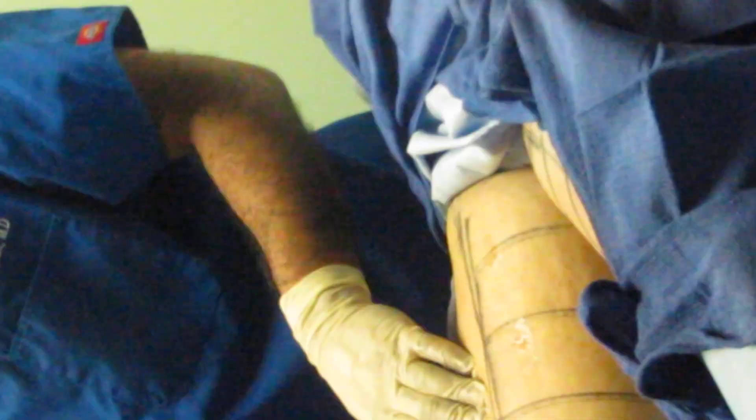We can go a little bit further down. Another approach from here is to take care of that. Then put the patient in a positioning pillow and try to make sure it's symmetrical and it's good.